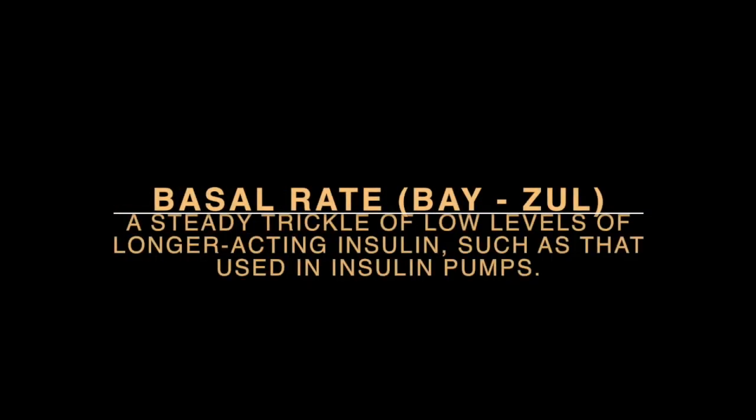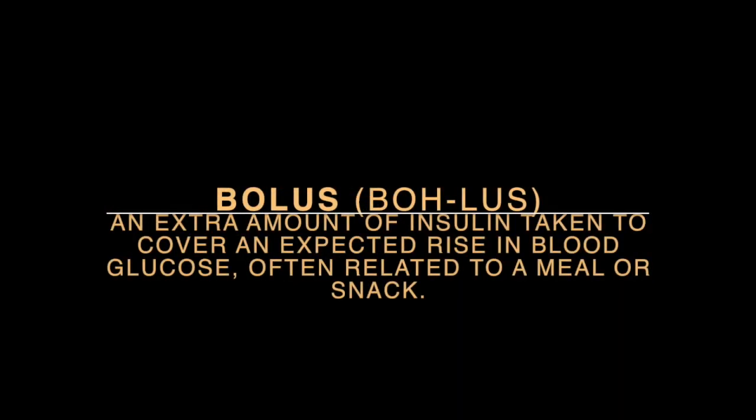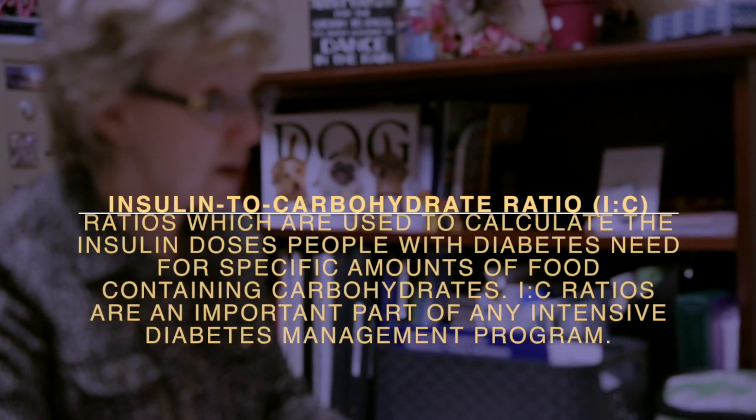You have a basal rate, or rates, and you'll have your bolus dose. That goes with the food and everything that we have to. Got it. Your insulin to carb ratios.